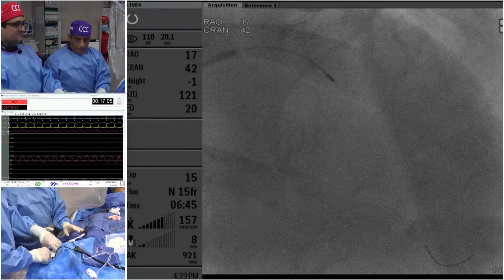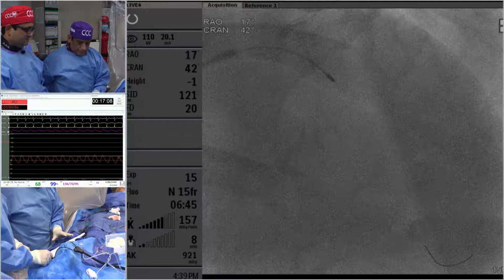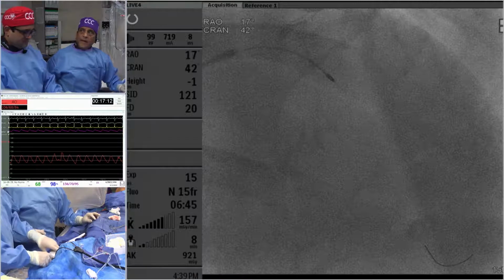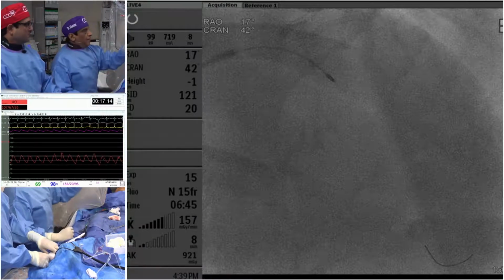You know, what it will be done is to just bypass the apex. I have a few cases like that, and those bypasses in these two cases have worked properly. Good. But it's very difficult. We are going to show that now. You see this?